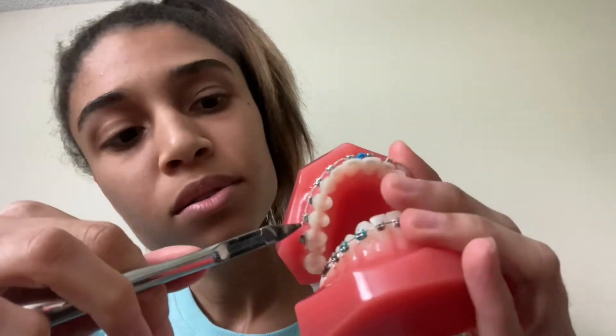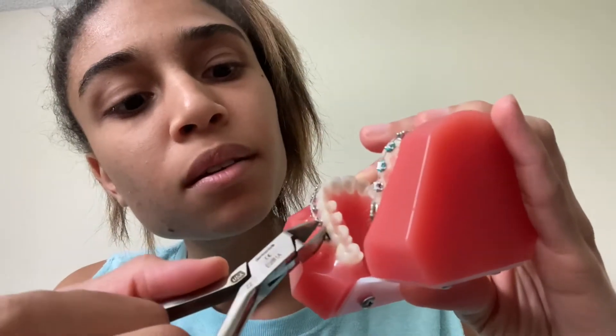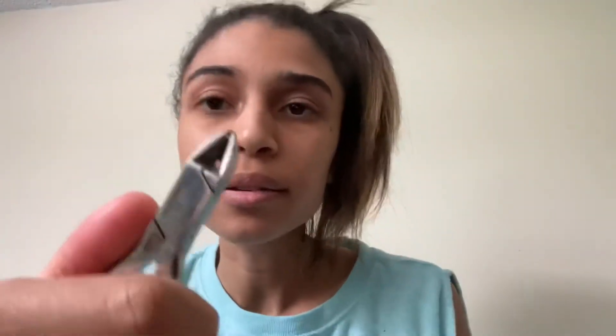My next pack are ligature cutters. I normally hold my stuff like this to get a good grasp on them. These are used to cut — not major wires — but ligature ties. You see the little tip — it'll be used to cut that. Cut and tuck is what I say.